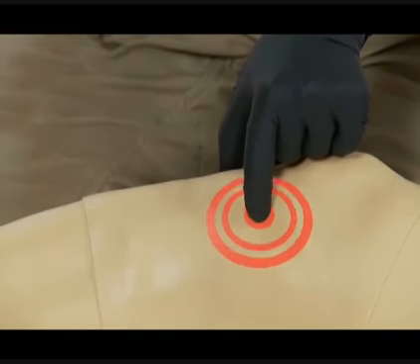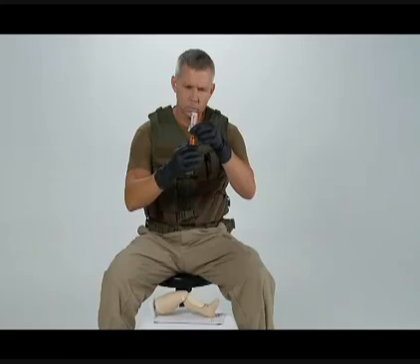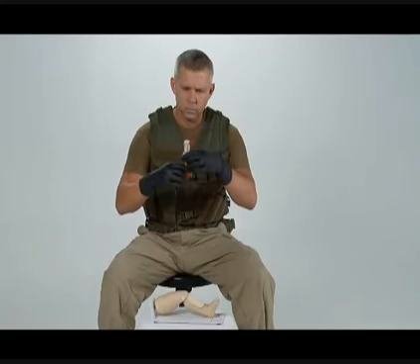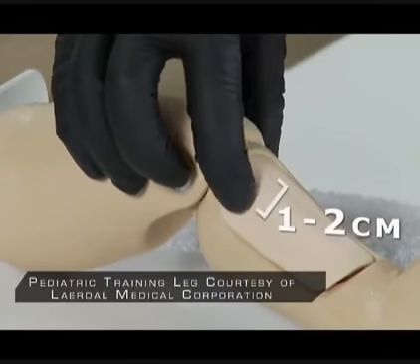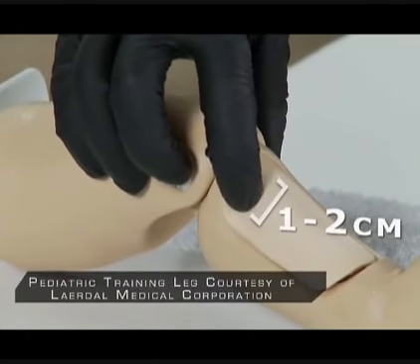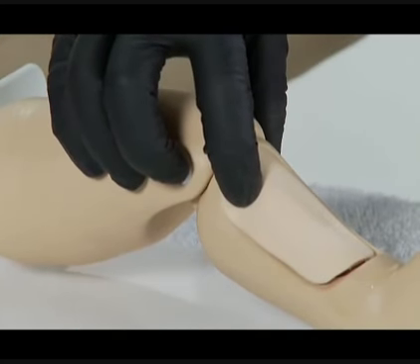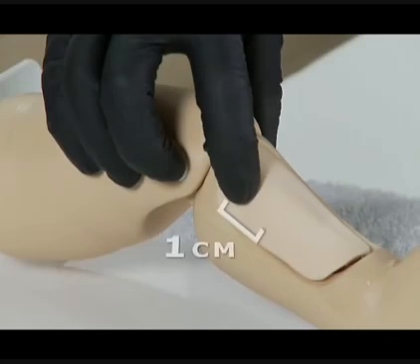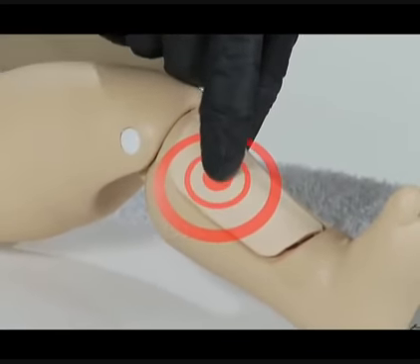Our goal is to deploy the needle through the thinnest portion of the cortex and in the area that contains the highest vascular content. For pediatric placement, find the same outset point, which is the tibial tuberosity. From the tibial tuberosity, go 1 to 2 centimeters toward the inner part of the leg to find the flat portion of bone called the tibial plateau. From the tibial plateau, go distally or down toward the foot approximately 1 centimeter or 1/2 inch.